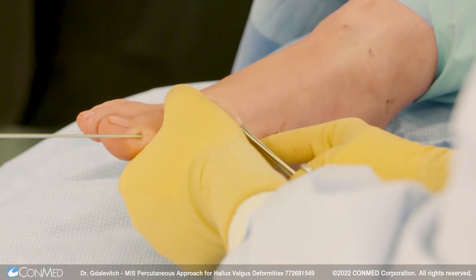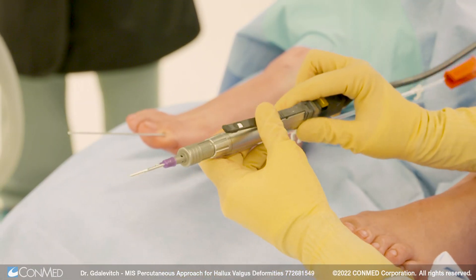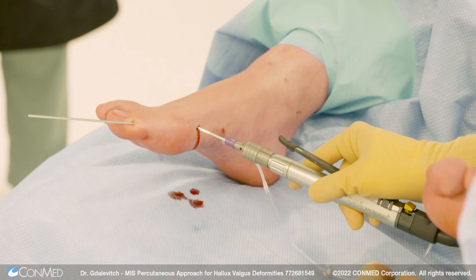A hemostat is then used to go above and below to clear the soft tissues before cutting the bone. An irrigation burr is then used — it's a high torque, low speed burr that will not burn the bone. The osteotomy is done at the metaphyseal-diaphyseal junction.